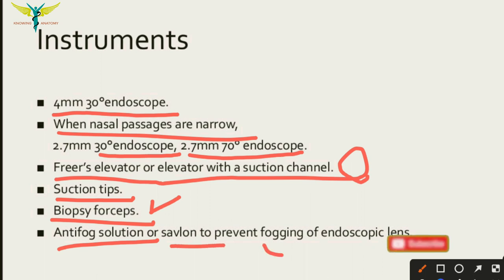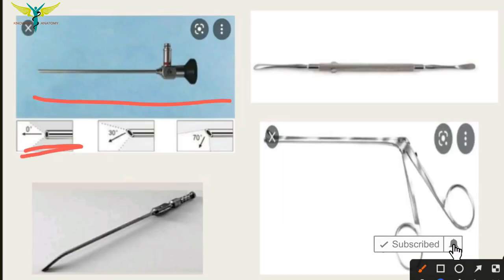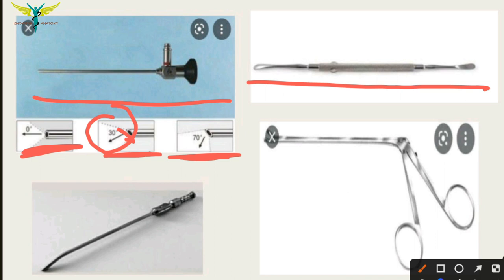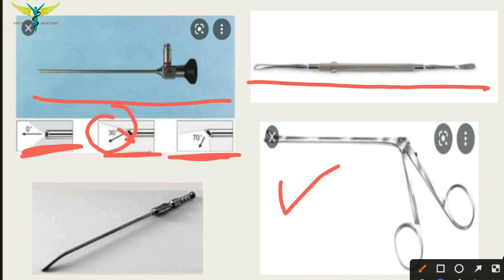This is the 0-degree endoscope; the 30-degree endoscope has a blunt angle directed at 30 degrees; and here is the 70-degree endoscope. This is the Freer elevator, and these are the forceps used to take out a biopsy.